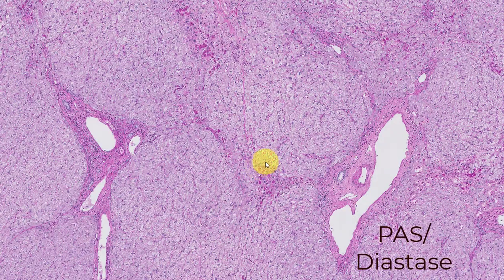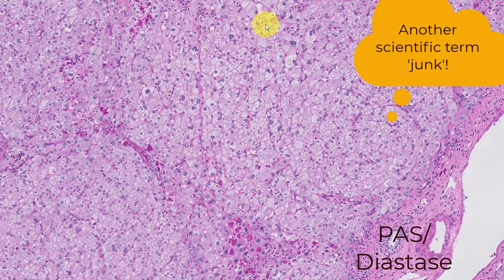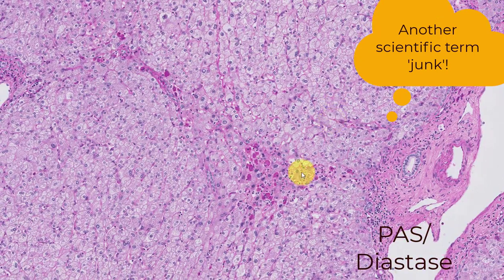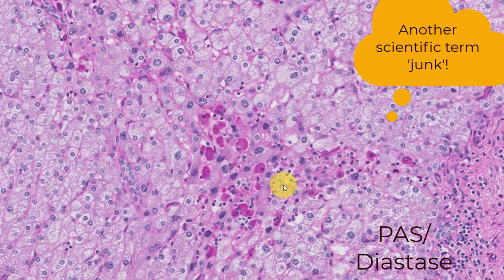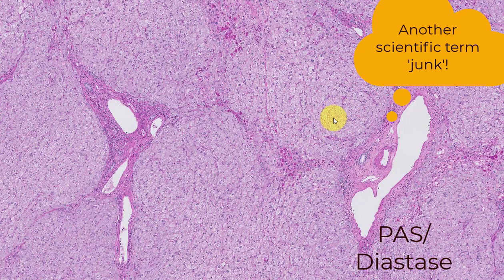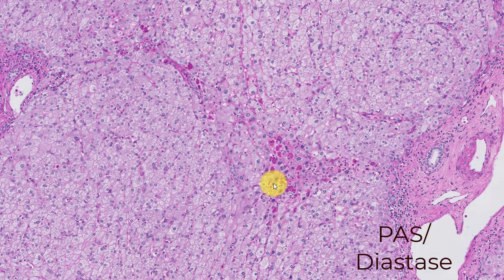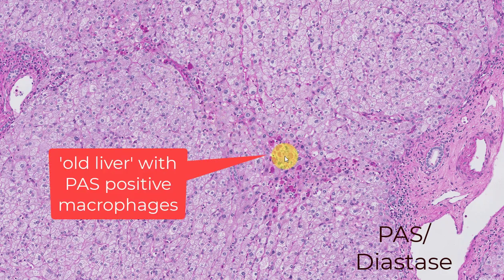NRH, that the nodular portion of the liver will lose its PAS positive junk, while in the periphery, so I almost like to think of this as new liver. So there's none of that cleanup crew in the new liver, but the periphery represents the old liver that was somewhat damaged and hence the cleanup crew.